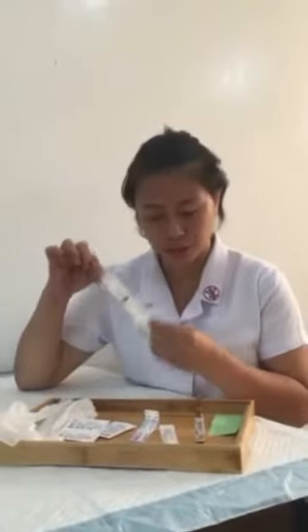Prepare the ampule medication for drug withdrawal, and whenever possible, change the needle on the syringe with a new needle, because the new needle is free from medication and it will avoid hurting or irritating the subcutaneous tissues when it passes through. Flick the upper stem of the ampule several times with a fingernail. This will bring all medication down to the main portion of the ampule.